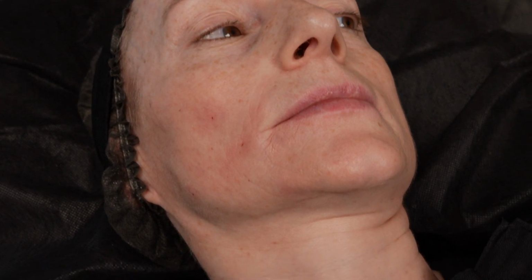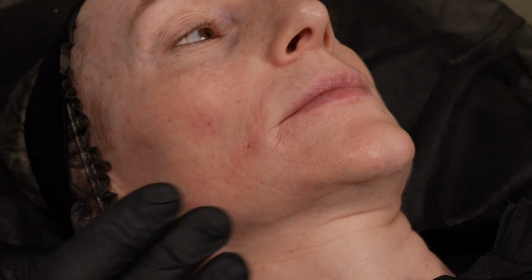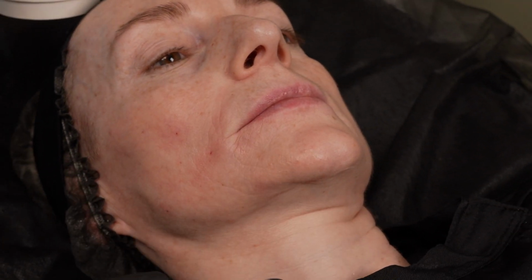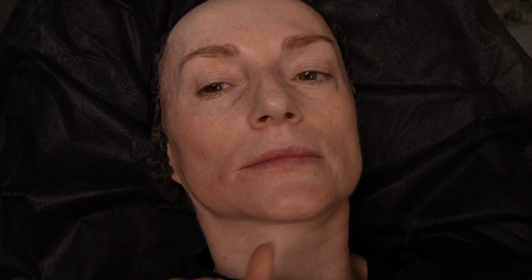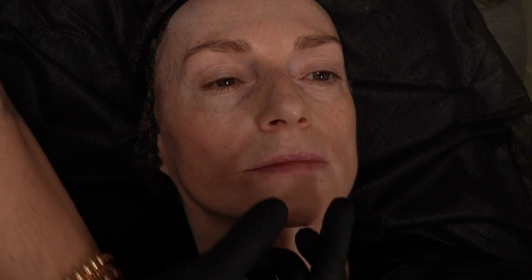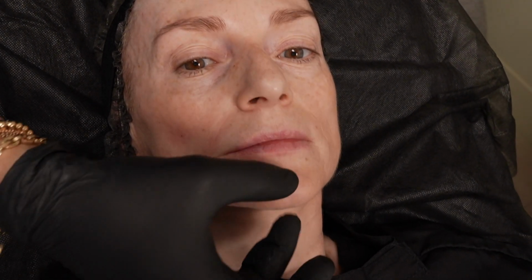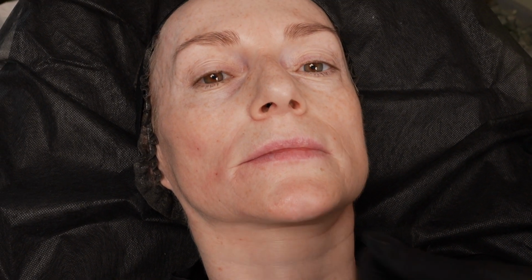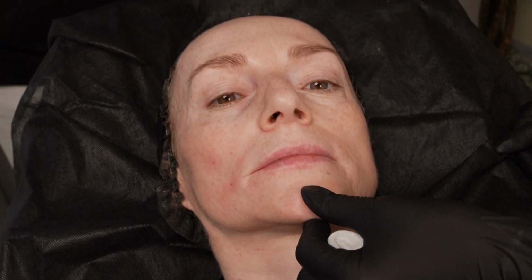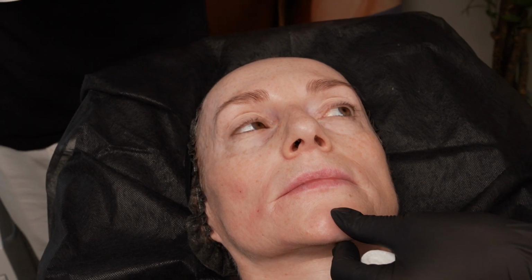Are you finished with the correction of that moment? I think it will be beautiful. Let's see the center and the superficial. Yes, just deep injections on the chin, not just this. Just to give it the heart shape, the curve. Let's do it with the needle. Don't open a new one.